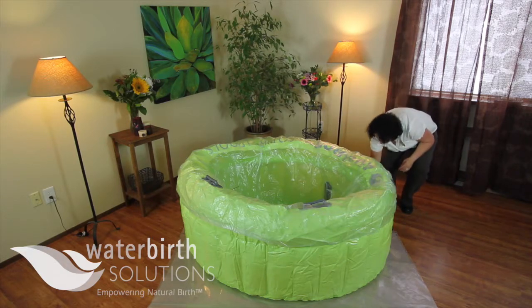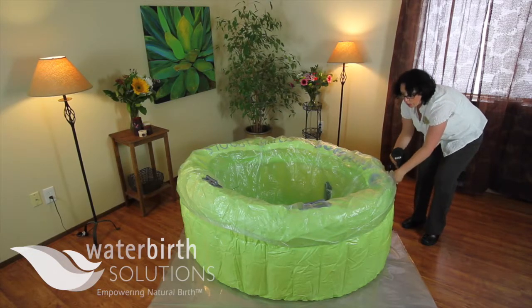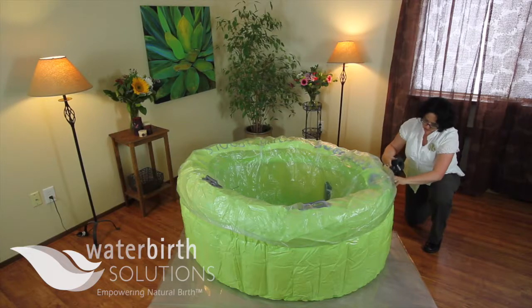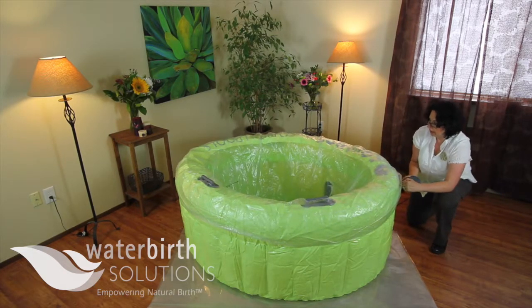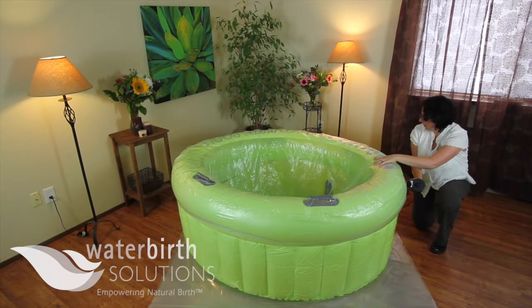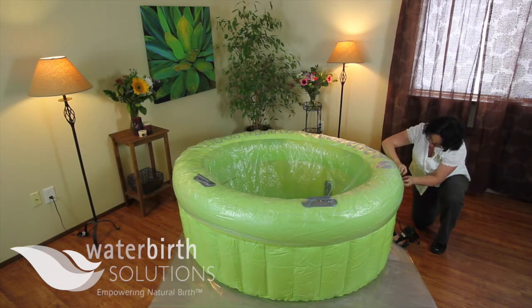Alright, let me go ahead and start pumping up the pool. I'm going to go to the top chamber first because that will definitely hold the liner in place. There are two ways to use this valve.